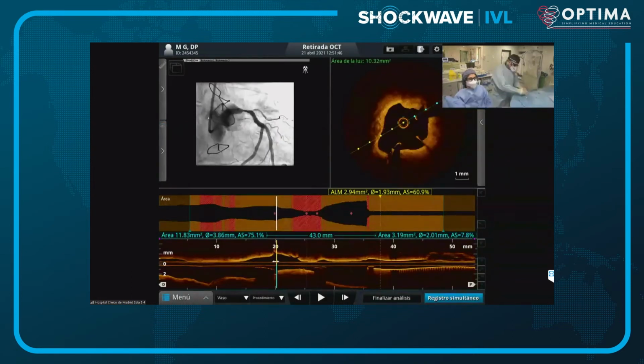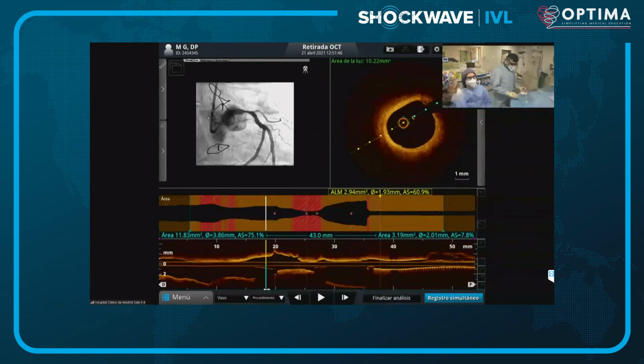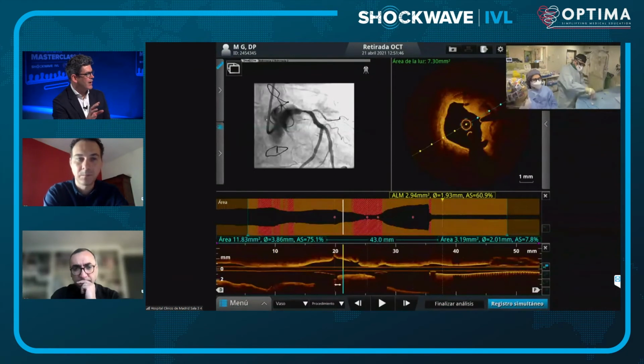So in the distal part, first of all, we have clearly improved the lumen because now we have good clearance that we were not able to have before. We can maybe later make a measurement here again for the distal reference. And we are entering the area and you can already see some fractures. If you just go back to that point, Nieves, just where you showed fractures.